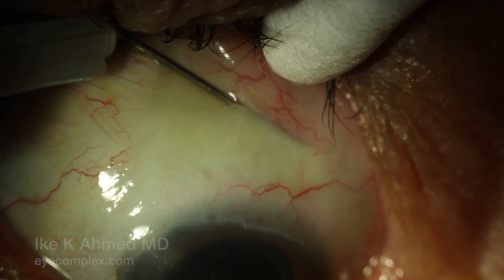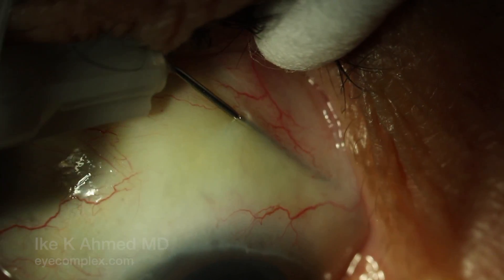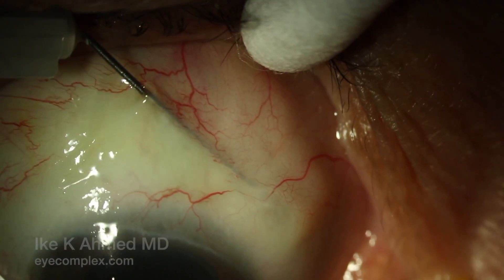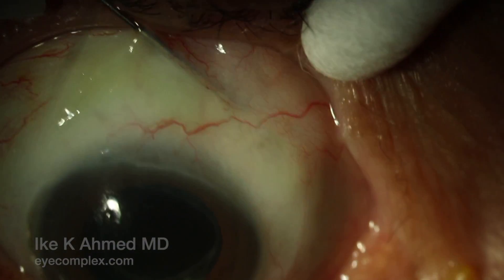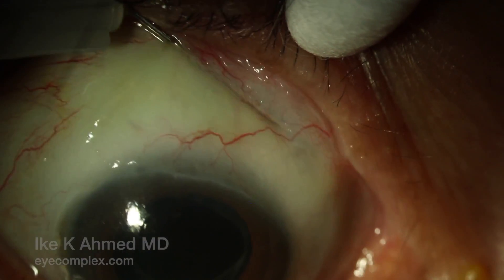A 27-gauge needle is used to pass under the subconjunctival space about 2-3 clock hours away from the Xen implant, which you can see is in the supranasal quadrant. What we first visualize here is the Xen implant — you can see it under the conjunctiva.